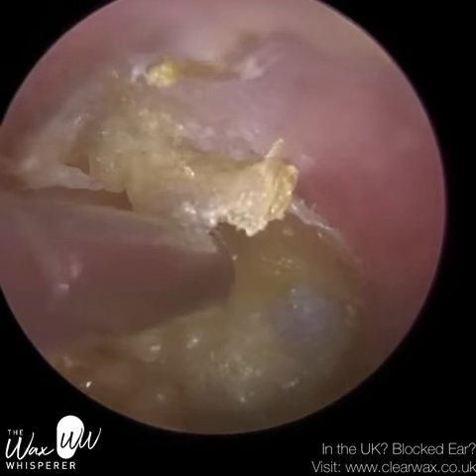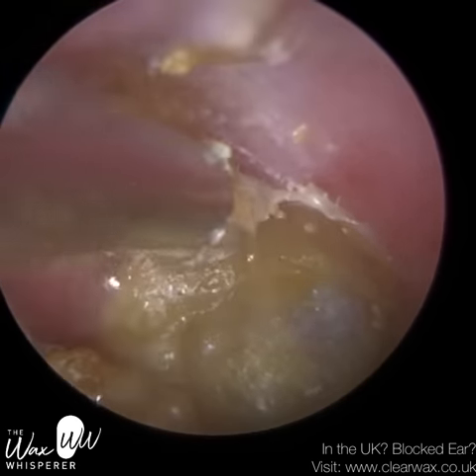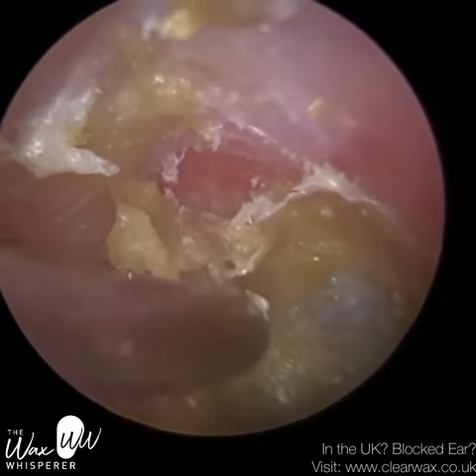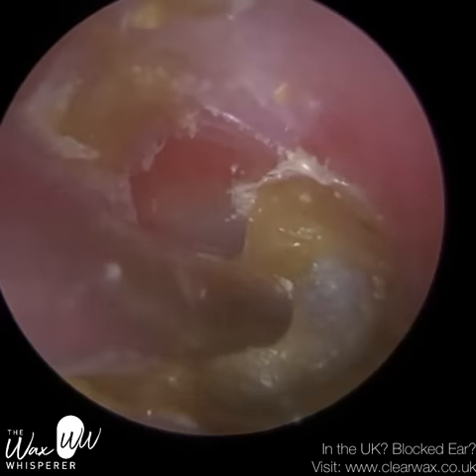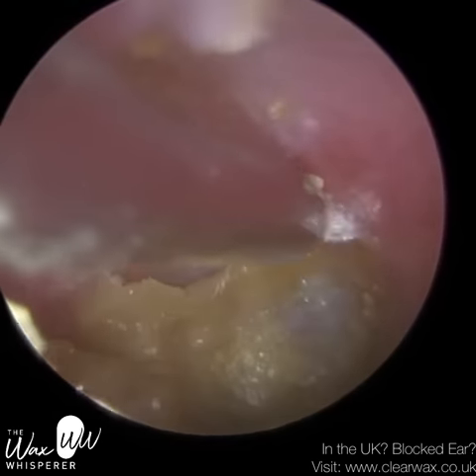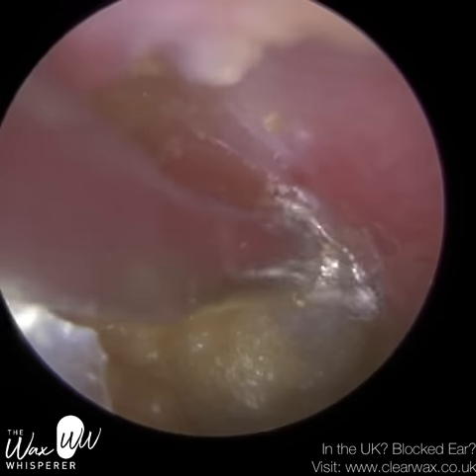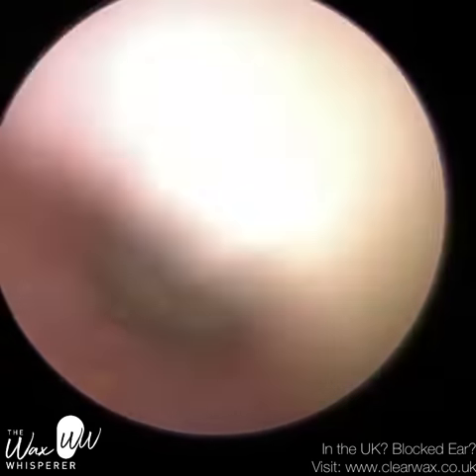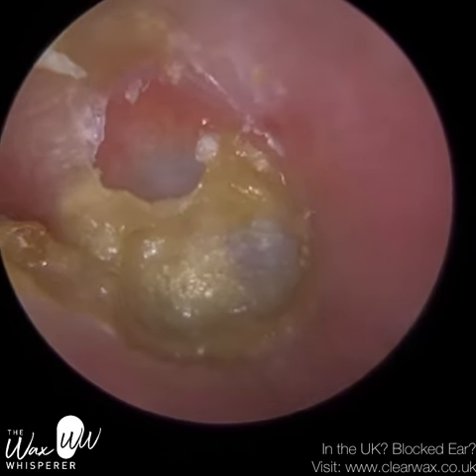I'm just trying to work from behind to see if I can peel this away — and I think I was able to peel it to reveal some of the top part of the eardrum, hoping that it would also be the case with the rest of the eardrum. I've also just kinked the suction probe a little bit, which enables me to get better access to the back part of the eardrum. Then I can rotate it the opposite direction if I want to remove some debris from the front part of the eardrum.